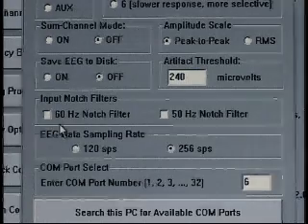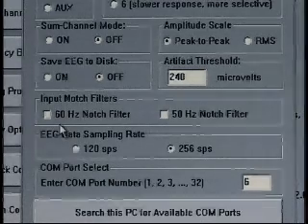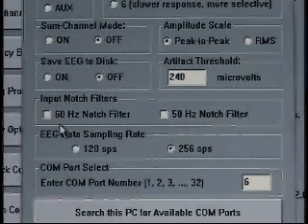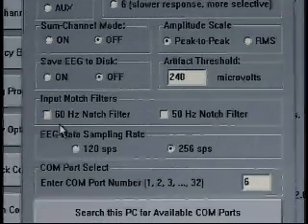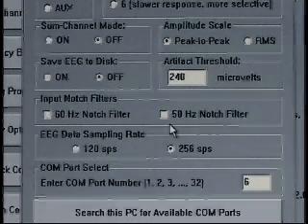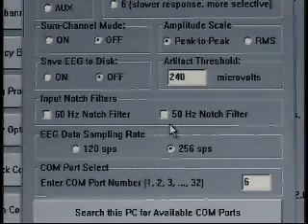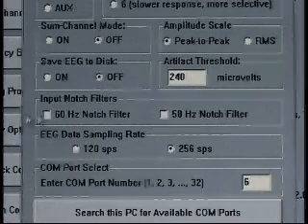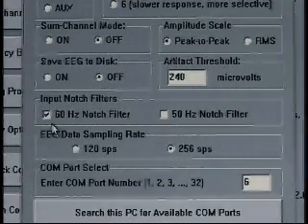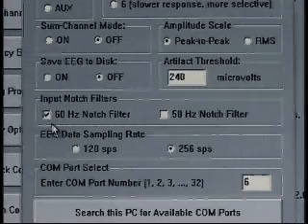We then continue down the box to Input Notch Filters. These filters help if there's outside interference in the room — laptop screens, fluorescent lights and so on. In North America, a 60 Hz notch filter is commonly needed because we have 120-volt, 60-cycle power. In Europe, South Africa, and Asia, a 50 Hz notch filter is usually what's needed because they have 240-volt, 50-cycle power. So we're going to go ahead and turn on the 60 Hz notch filter. It is also important to make sure that your impedances are good if you're going to use a notch filter — we want to make sure we're training EEG and not just training noise.